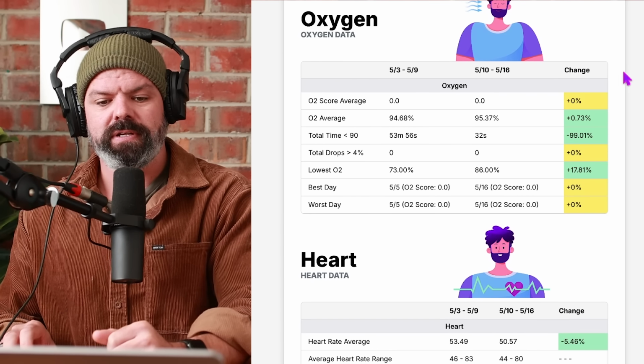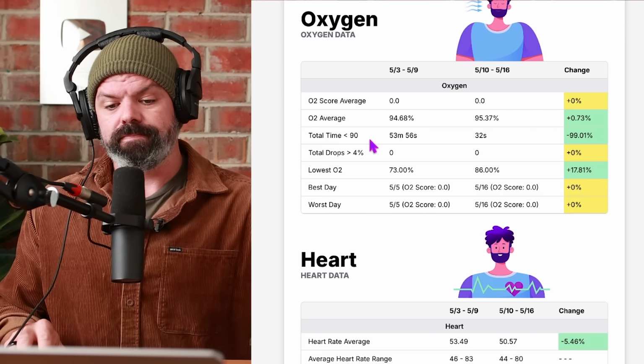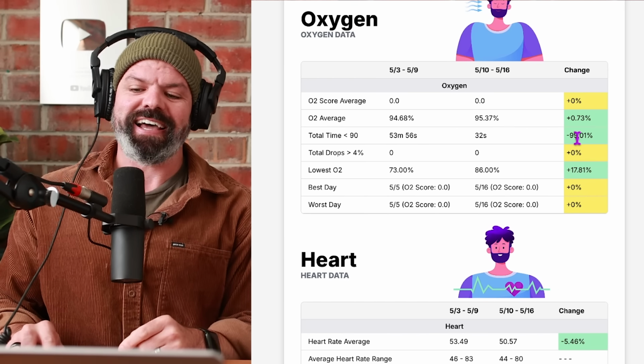This is pretty cool. Look at this. Total time spent below 90. 53 minutes and 56 seconds. Over the course of the week, he was below 90. Now it's just 32 seconds. Look at that.